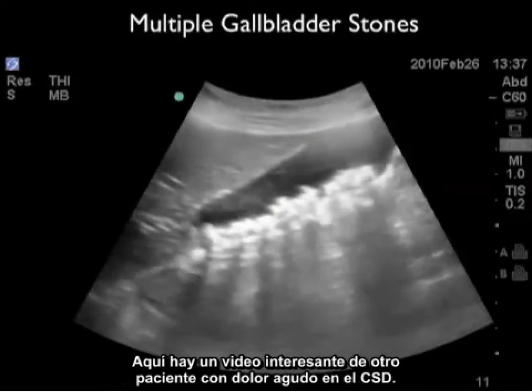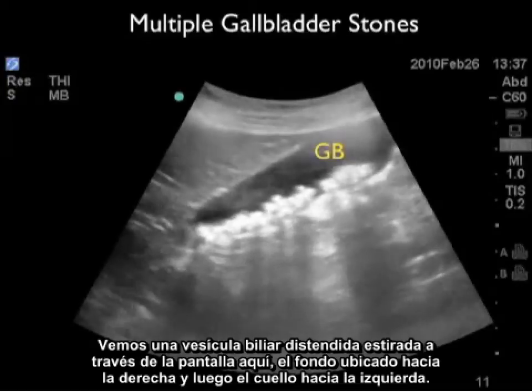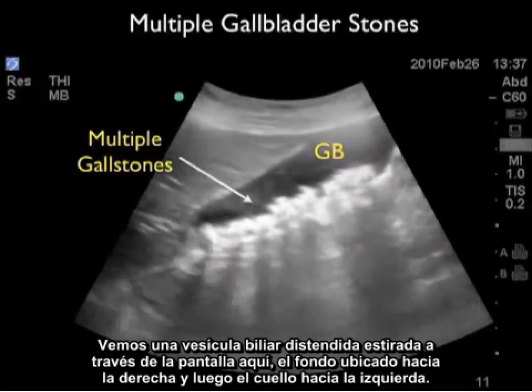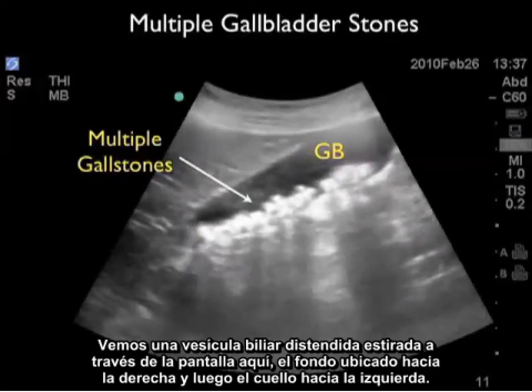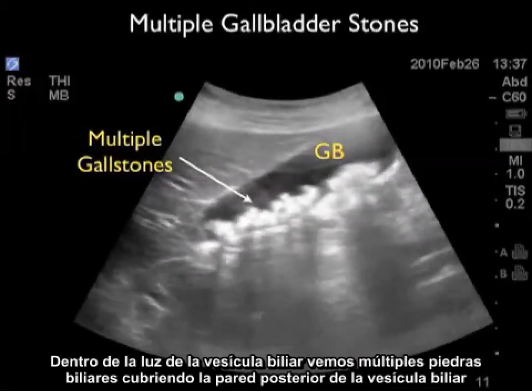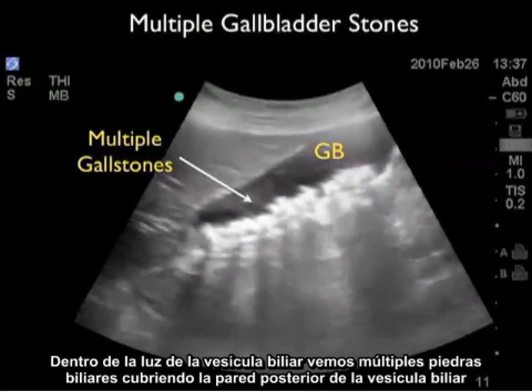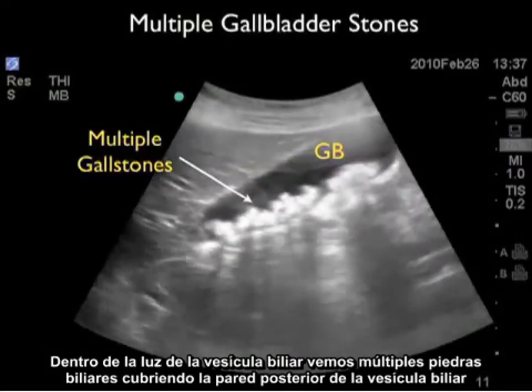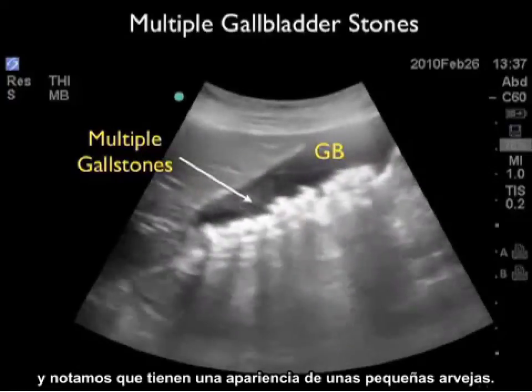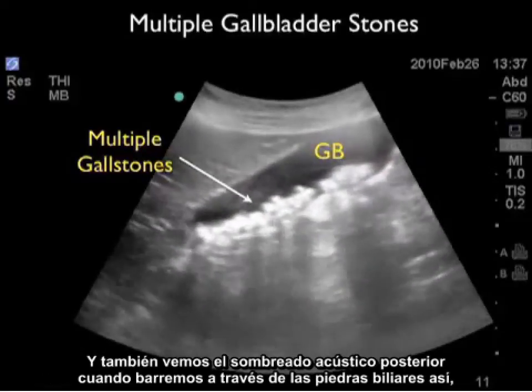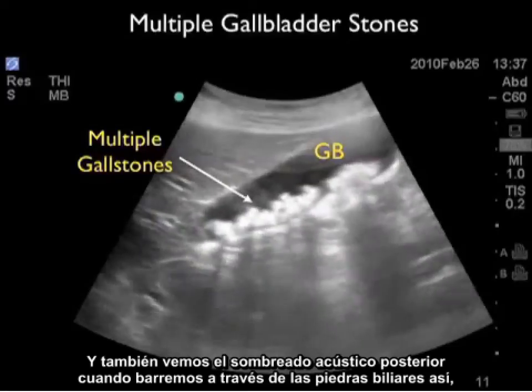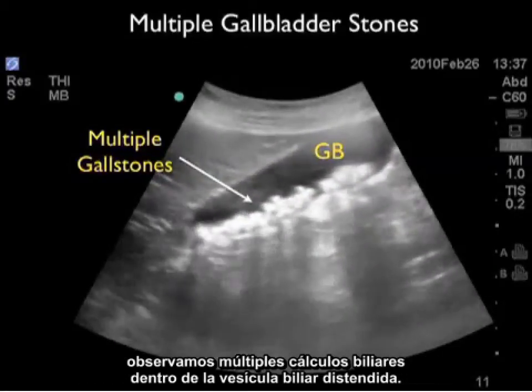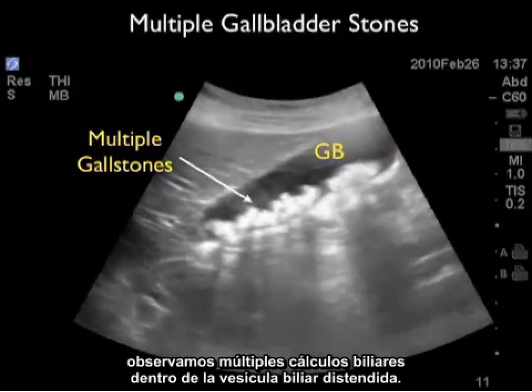Here's an interesting video clip from another patient with acute right upper quadrant pain. We see a distended gallbladder stretching across the screen, with the fundus to the right and the neck to the left. Within the lumen we see multiple gallstones layering across the back wall of the gallbladder, with an almost small pea-like appearance. We can also see posterior acoustic shadowing as we scan back and forth — multiple gallstones within a distended gallbladder.